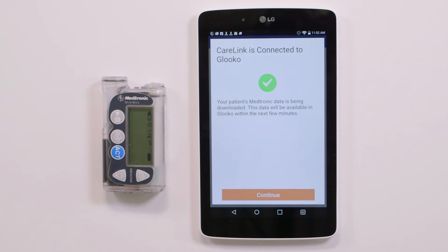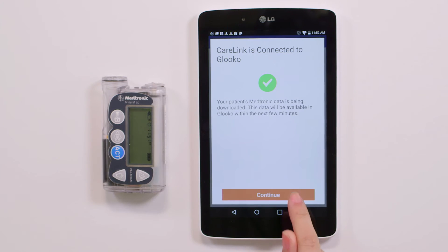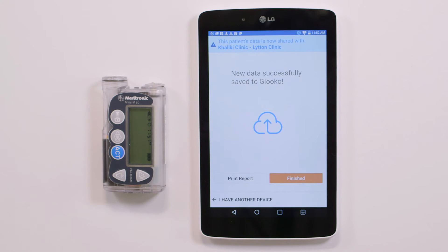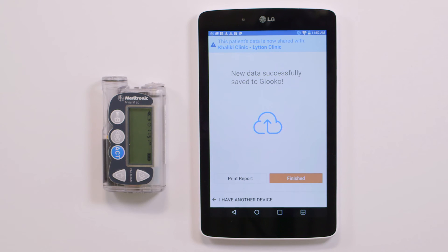The download will now begin and may take up to five minutes, depending on how much data is stored on the patient's Medtronic device. Once the connection is complete, you have several options. You may choose to print a report of this patient's data via your wireless printer, sync another device for this patient, or tap Finish to complete your use of Gluco Kiosk for this patient.